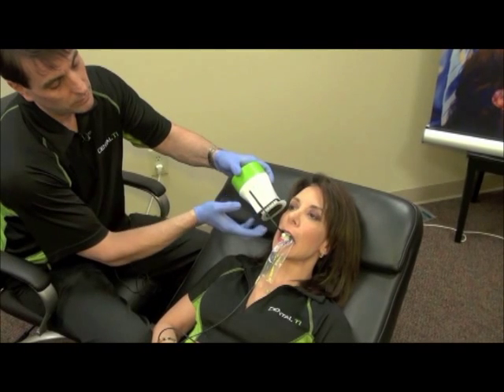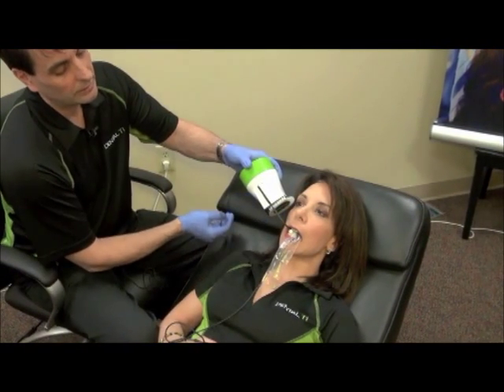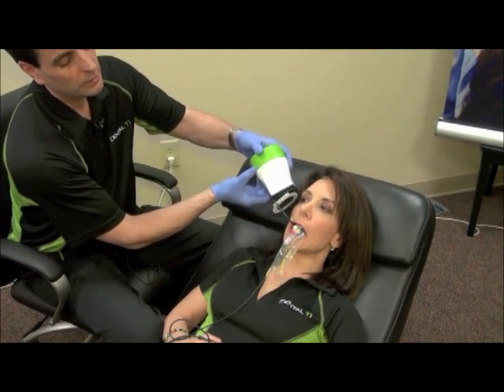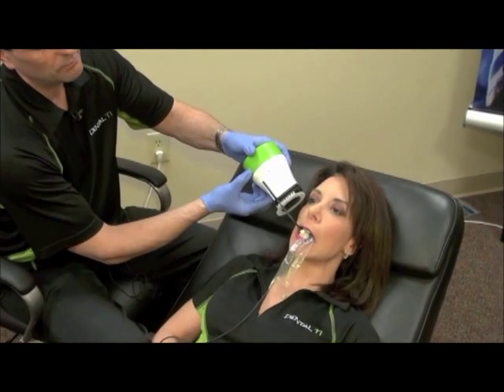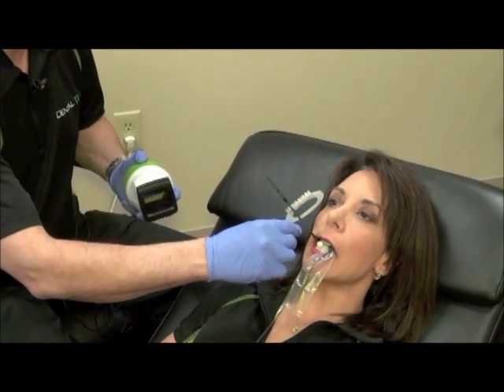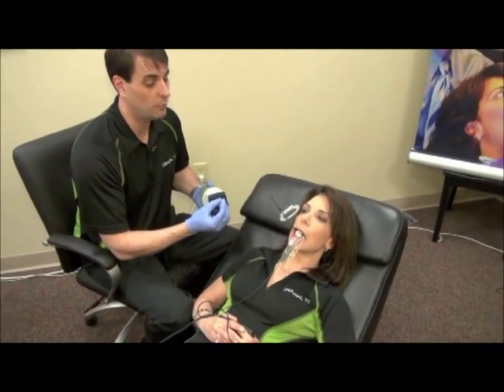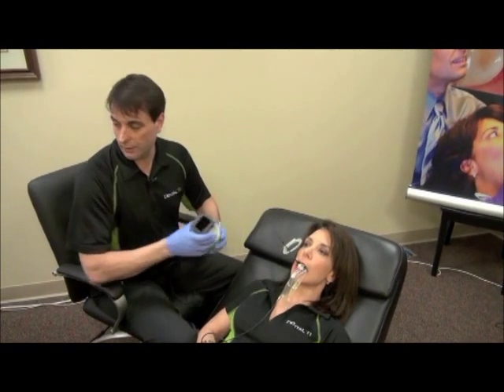When you're taking this x-ray, the x-ray tube will be flush with the alignment ring. Now if the patient has a shallow palate, you can always raise the tube up and drop the angle a little bit — I recommend about a half of an inch up, dropping the angle, and that will allow you to pick up the apices. I only recommend doing that if the patient has a really shallow palate and you're not able to get the apices with the correct angle.